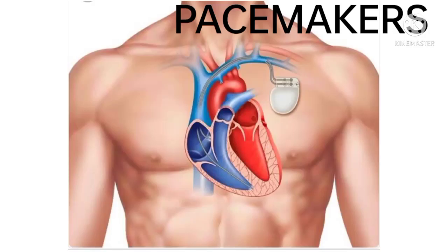Pacemakers, Advanced Nursing Practice, 5 Marks. Introduction. Pacemakers are electrode devices that can be used to initiate the heartbeat when the heart's intrinsic electrical system cannot effectively generate a rate adequate to support cardiac output. Currently available permanent pacemakers contain a pulse generator and one or more pacing leads. Further innovations in the pulse generator and its circuitry extended the utility of the percutaneous technique even in very young patients.